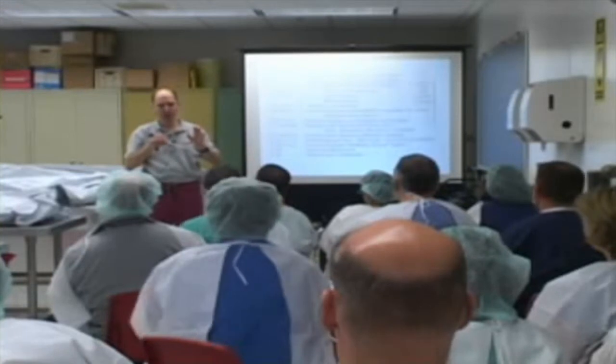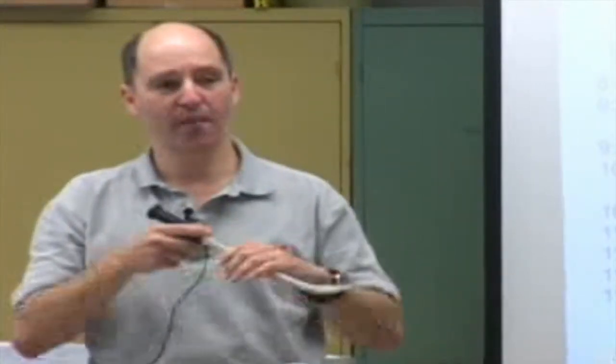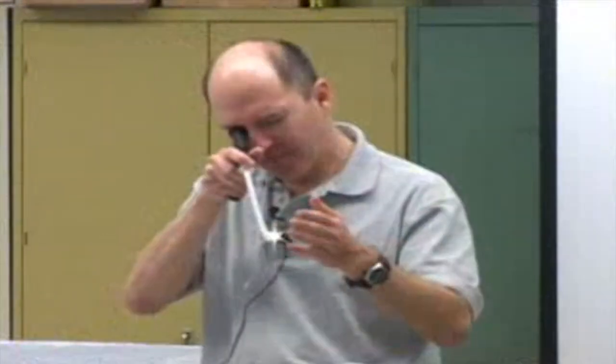A couple of fine points about tracheal tubes on stylets. When you set this up, turn on the light first and confirm you have a good view. These tubes have been in and out of cadavers — there may be goop. If the moment you go to the eyepiece it's cloudy, that's not a problem with you and the scope in the body; it's goop on the stylet. Take it off, wipe it, and recheck.